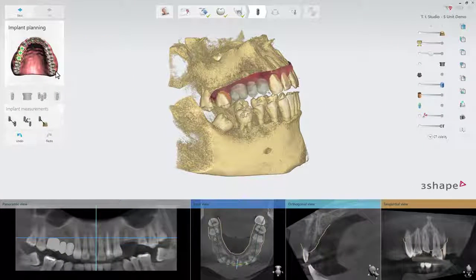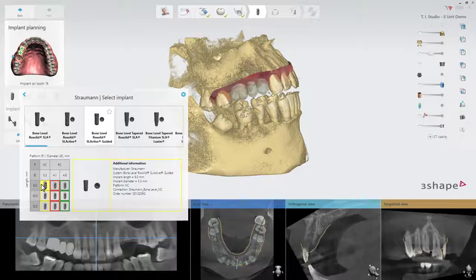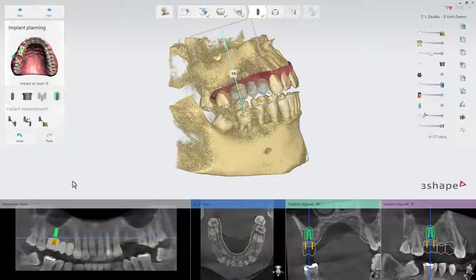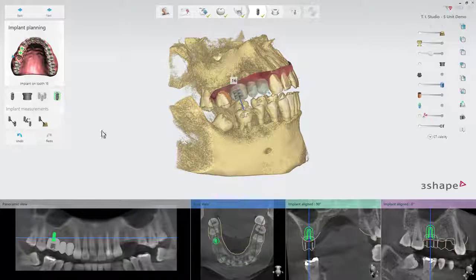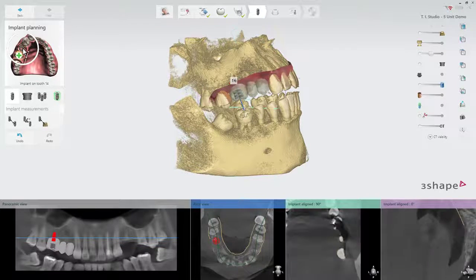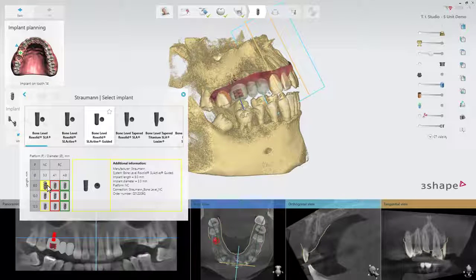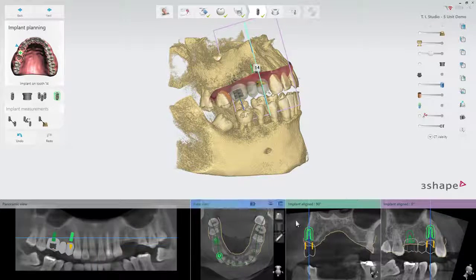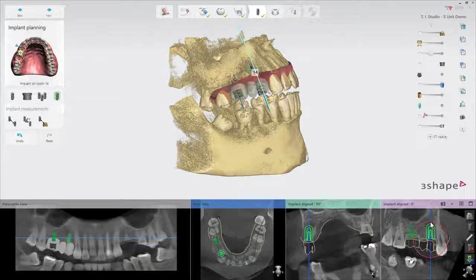In the implant planning step, you can set two implants instead of the three proposed, or perhaps add an extra anchor pin if the situation requires it. The anatomy design will be kept for all crowns, saving you time as you do not have to go back to the order form to change the indications. Use the regular Implant Studio tools to finalize the planning.